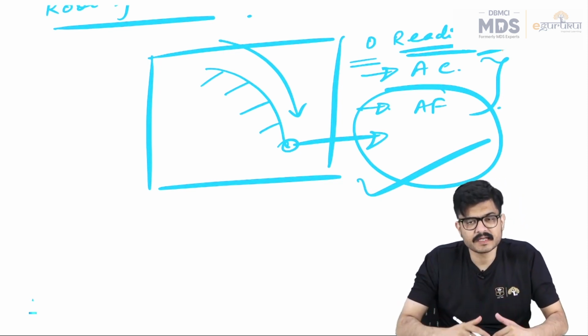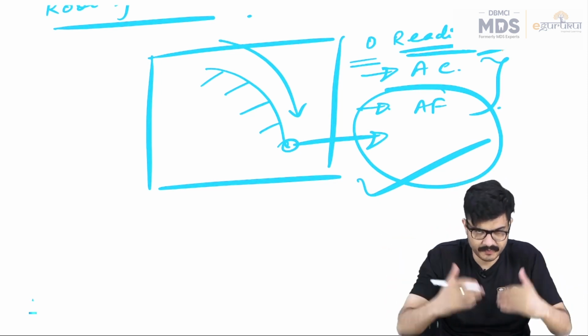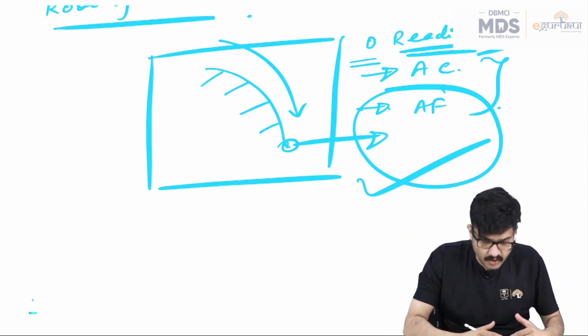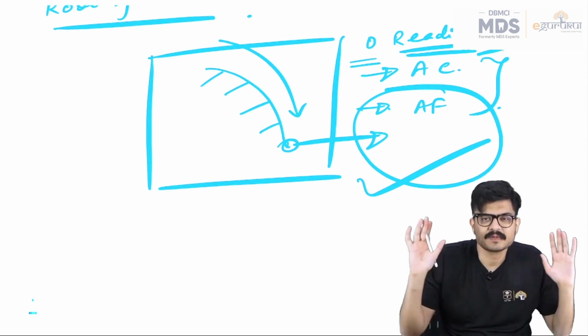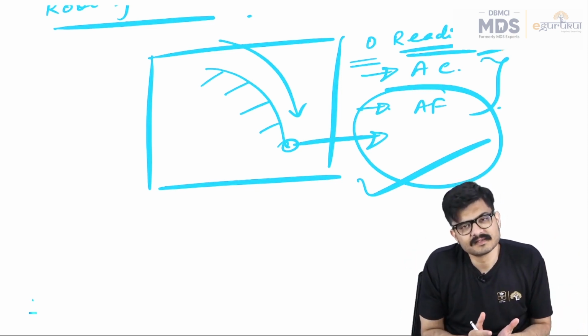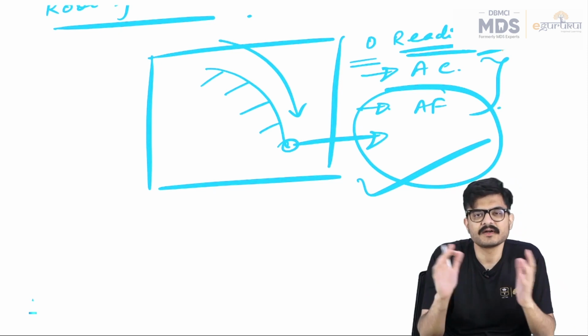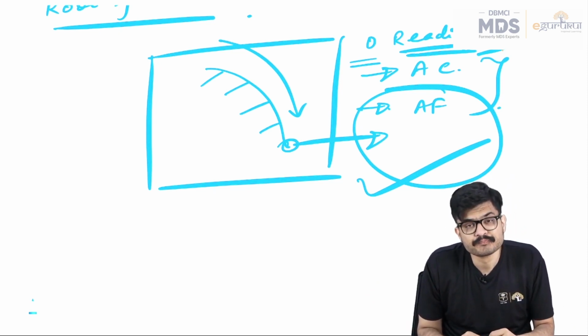And now this is a practical tip: when you're treating your patient, from the zero reading, as a safety value, reduce about 1 millimeter, just like what Engel did in his radiographic method. That would be somewhere near your apical constriction, or slightly short of that, that's okay. Right, friends?